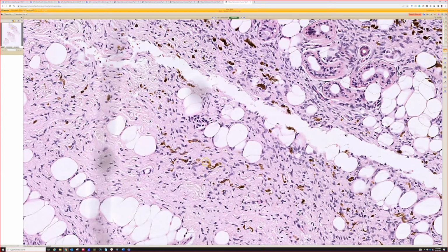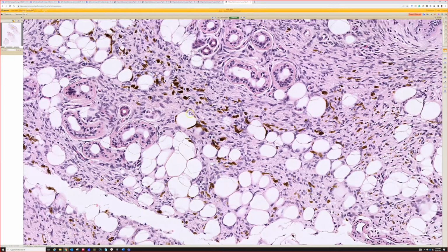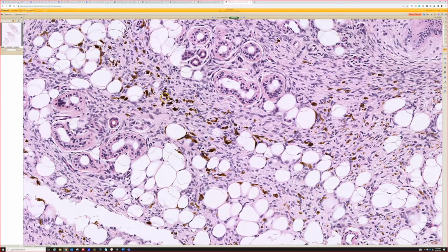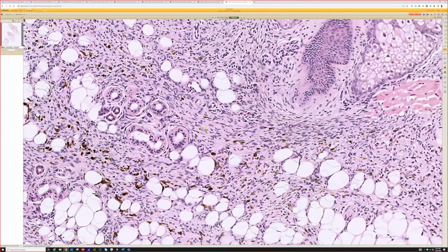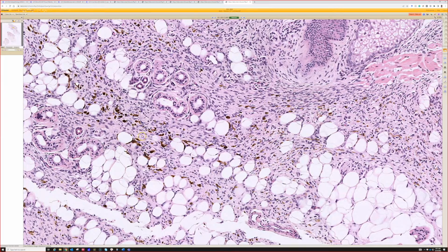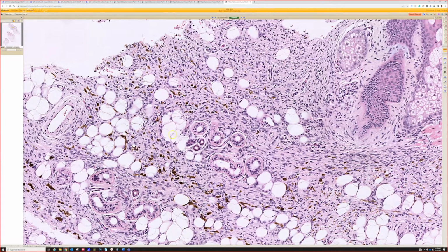If we did a stain, this would be positive for Fontana-Masson, negative for iron stain. So when we see these pigmented dendritic melanin-producing cells, I believe they're just spindled melanocytes. I don't exactly understand how they get into the tumor. I'm sure that there's some literature on that I'm just not as familiar with. But they are these spindled melanin-producing cells scattered in the midst of an otherwise normal DFSP.